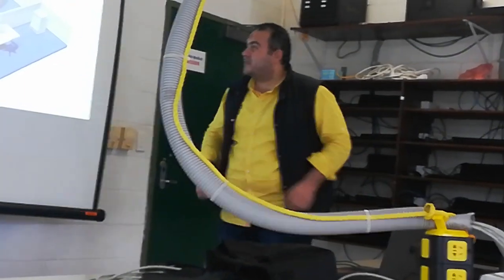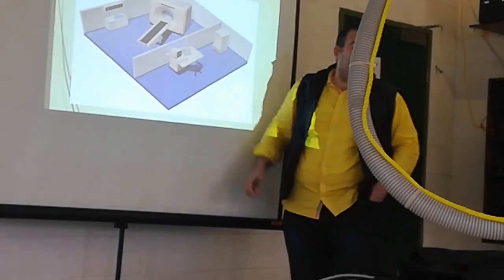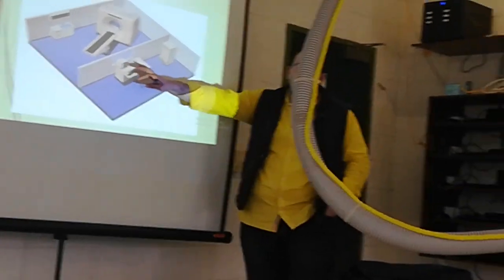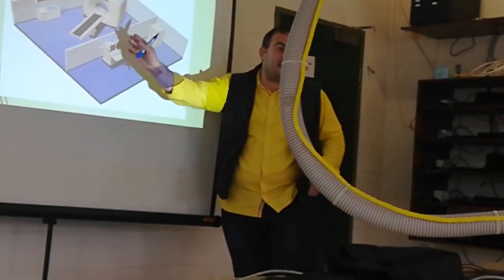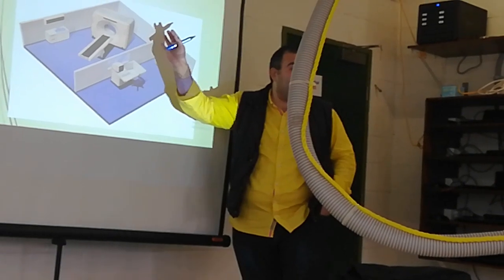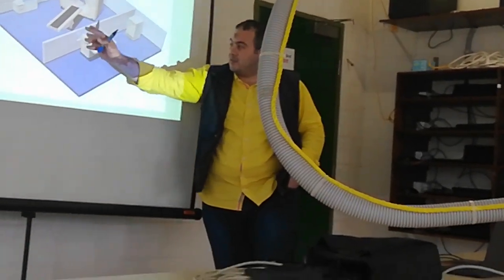This is the layout for the CT room. Inside the CT room, you will find the main gantry and the patient table, okay? And outside you will find the control room, the console, and this barrier is a lead shielded barrier, and this window is lead glass.